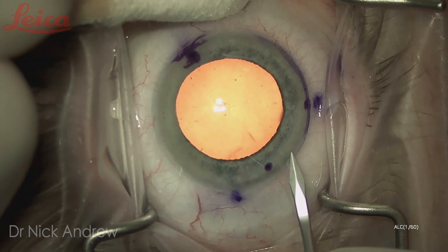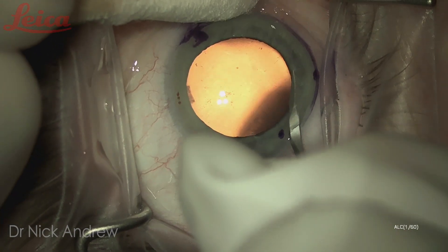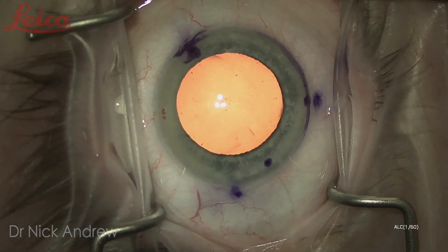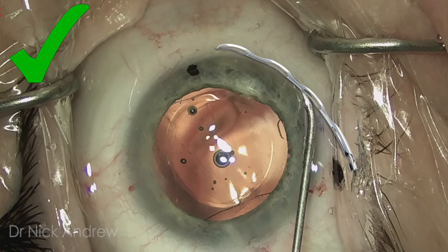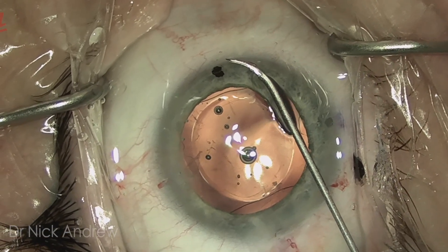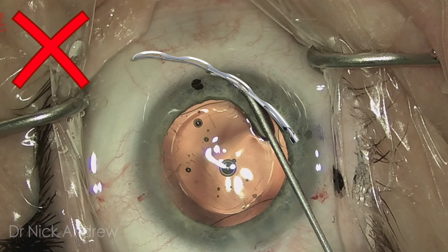For a right-handed surgeon, you want your hydrus incision to be pointing towards the limbus on your right, and you want the incision just wider than one millimeter. This will allow you to have a perfectly flat angle of attack so that as the hydrus is delivered, it will naturally follow the contour of the limbus. You don't want to implant the hydrus directly opposite you, as this will result in a steep angle of attack to Schlemm's canal.